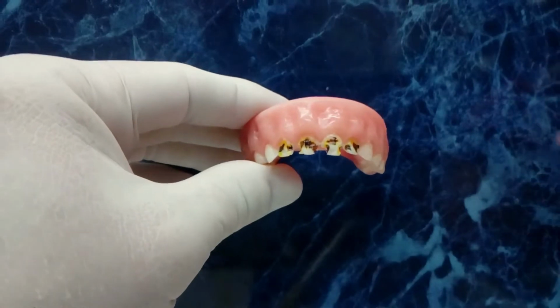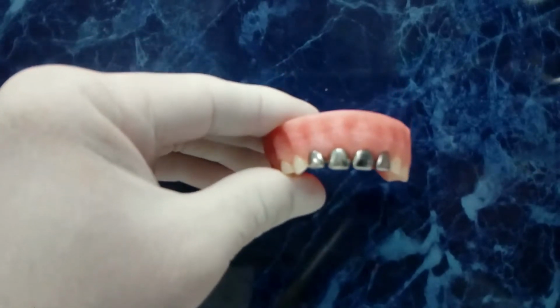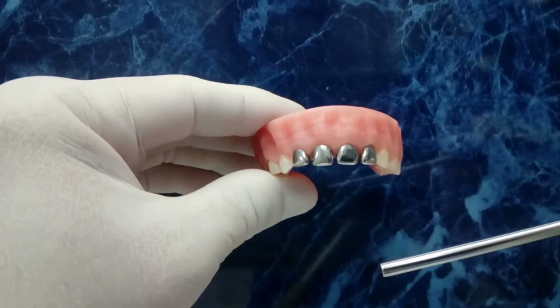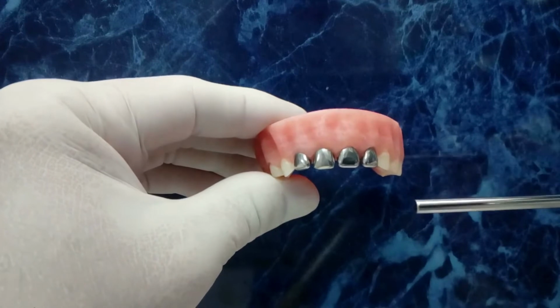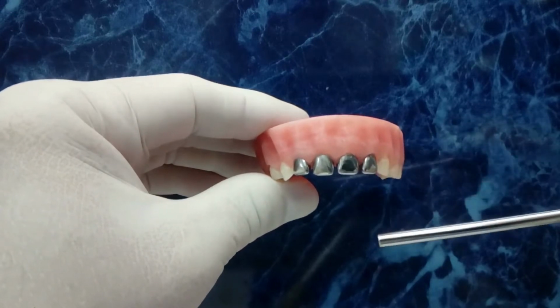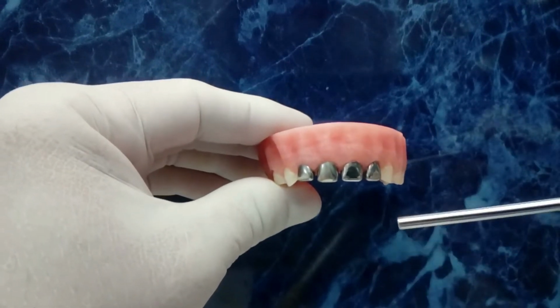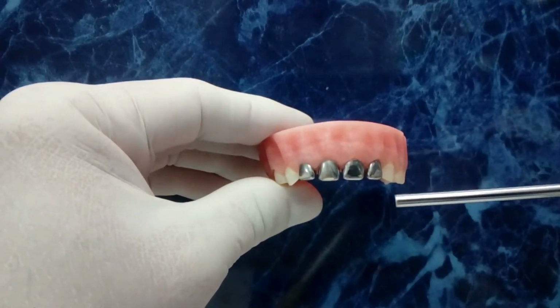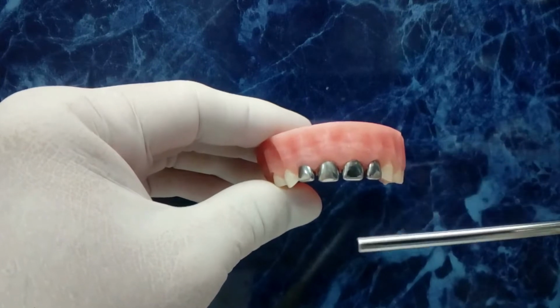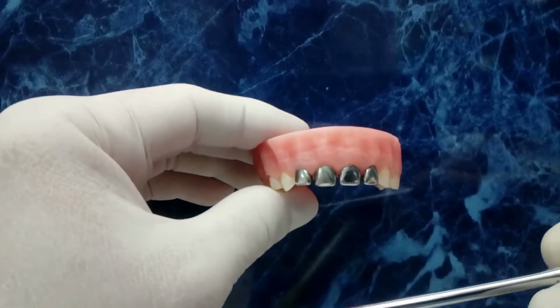From the end of the 1940s to the present, the most practical, effective, and economical way to treat this type of tooth decay throughout the world is through the use of these metal caps or crowns, which, although they are quite ugly, serve us to completely cover the healthy remnant of the tooth after all cavities have been removed. With these metal crowns, the tooth's shape is reconstructed and it functions during the useful period of the infant teeth. Subsequently, from the age of 6, the change of dentition will begin and the crowns will be replaced by the permanent teeth. But as you can appreciate, these crowns that have spoiled children's smiles for more than 70 years are already an unacceptable aberration in our times.